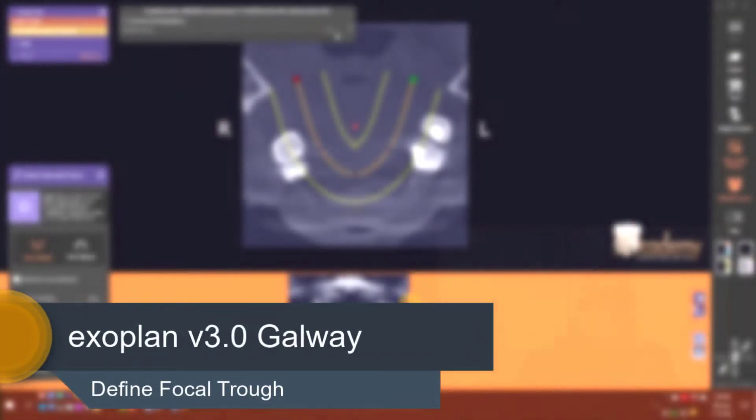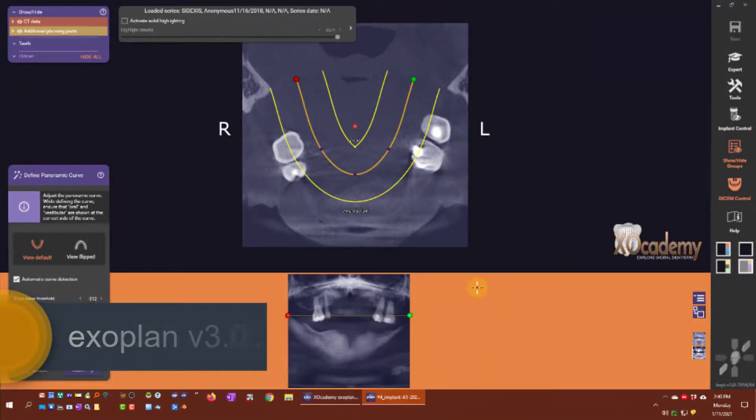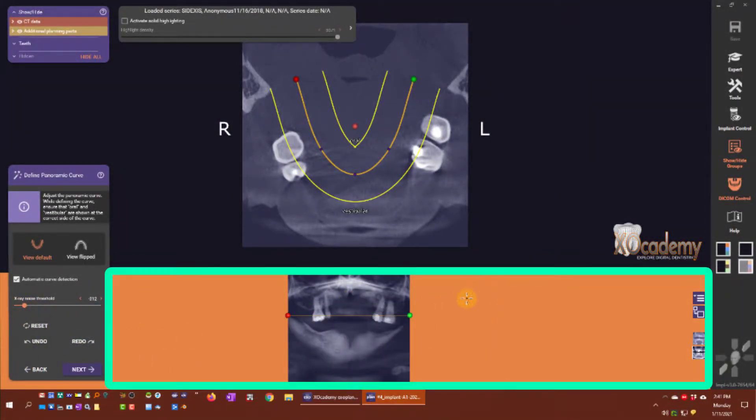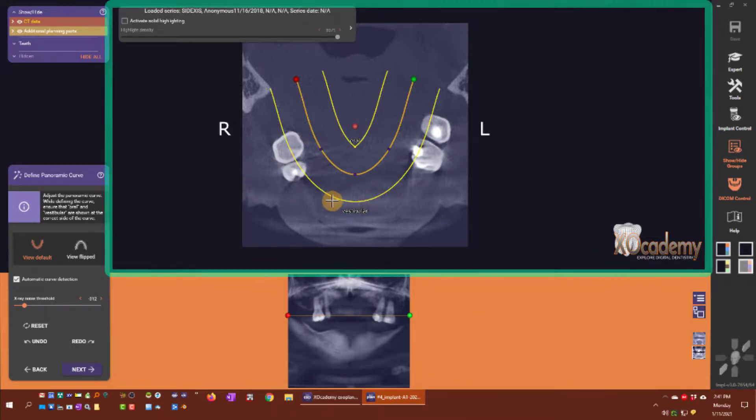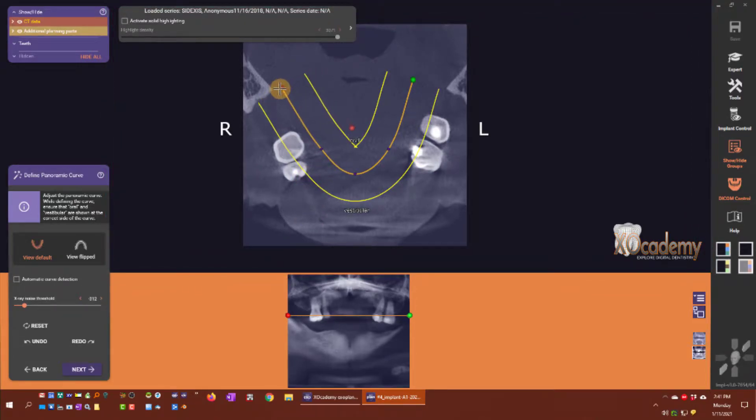Now we're going to define the curve. We have two windows here: the lower window is our panoramic composite and the upper window is our axial view. You can see we have a red control point here.